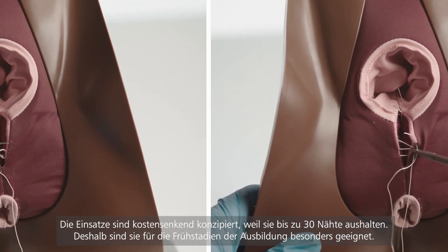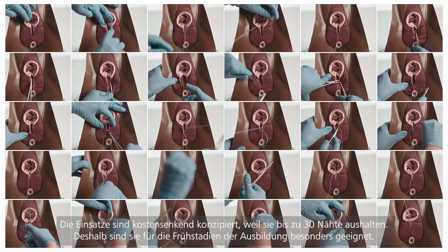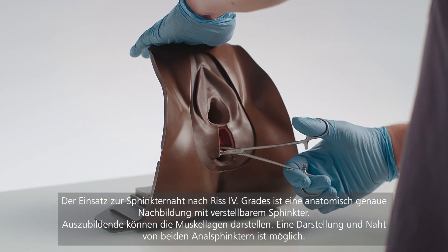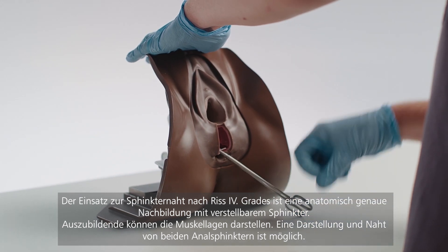Economical by design, each pad allows for up to 30 full repairs, making them perfect for early skill acquisition. The high-fidelity anal sphincter repair block represents a fourth-degree laceration and features a retractable anal sphincter.